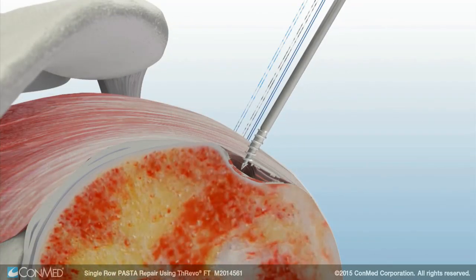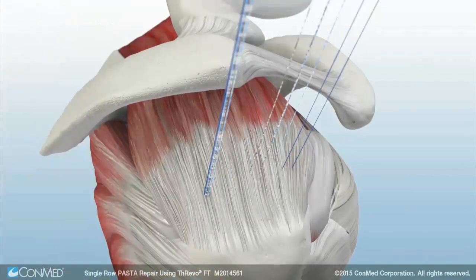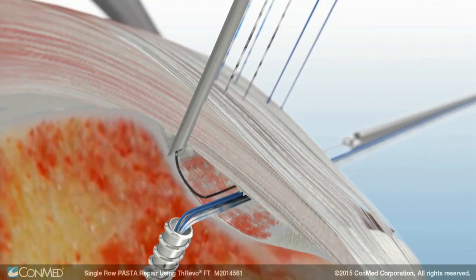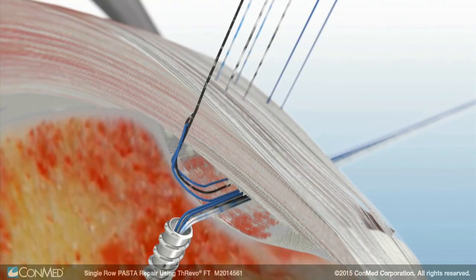A second anchor is placed and the process of passing the sutures is repeated. A spinal needle is passed through the tendon and the super shuttle is used to pass all sutures working anteriorly to posteriorly.